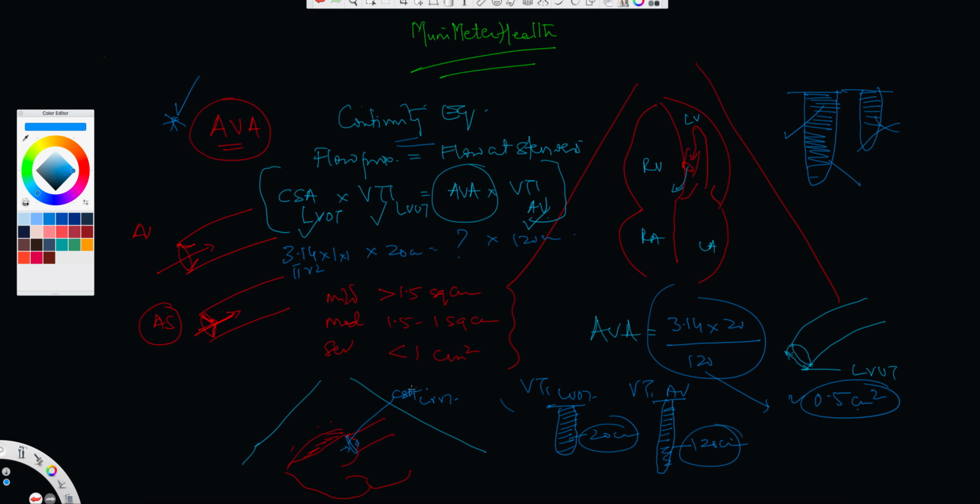Number two, when you're measuring the cross-sectional area at the LVOT, always measure that in the long axis view, just like I've shown it here, and there you're measuring it in the mid-systolic frame, if you will, and the inner edge to inner edge is calculated right beneath the aortic valve leaflet excursion. Don't measure it here, that will be incorrect. Measure it right here beneath the aortic valve leaflets, that's allowable. Okay, and then of course half the diameter would be a radius, and then compute that into the pi r square, which will give you the cross-sectional area. Okay, so as simple as that.